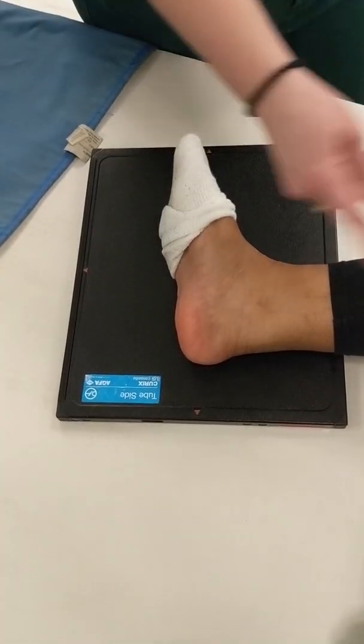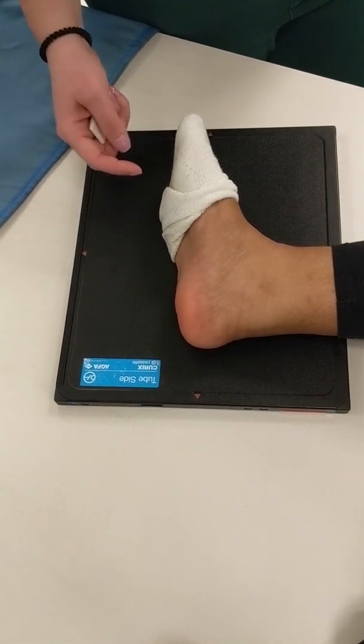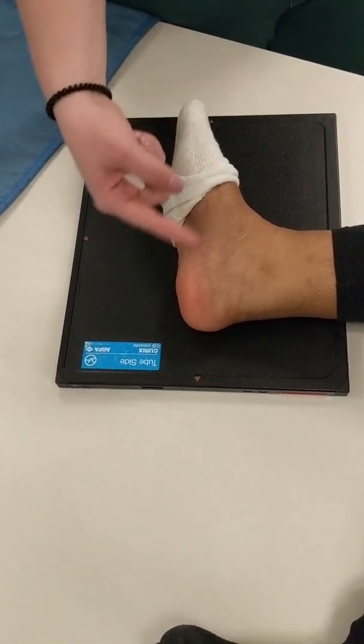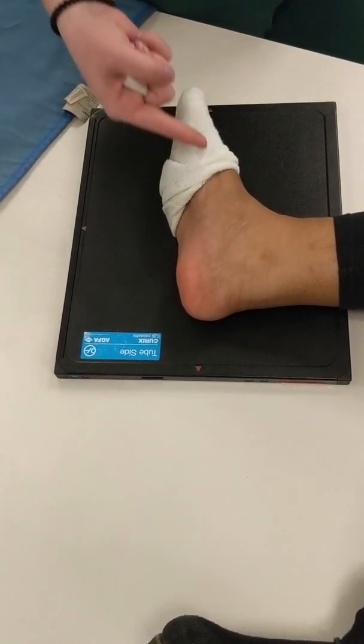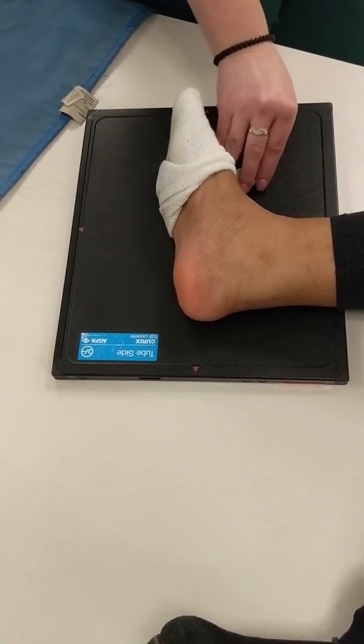So we've had her dorsiflex her foot. We've turned the IR crosswise, but really it runs with the length of her foot. So the length of her foot aligns with the length of the IR. There's a 90-degree angle between her tibia and her foot. The marker is going to come anterior and superior.